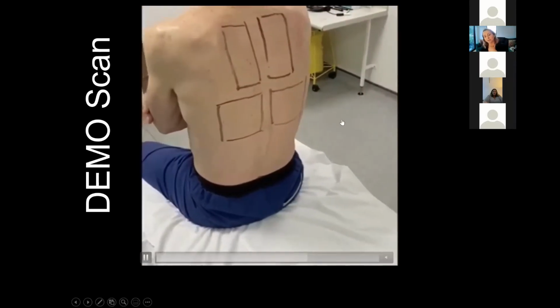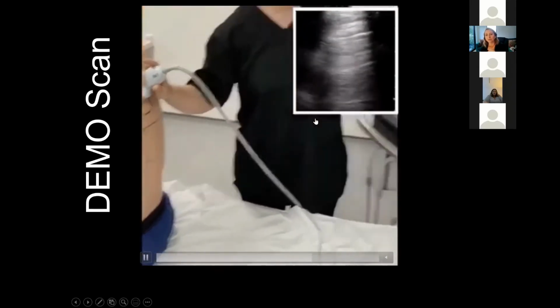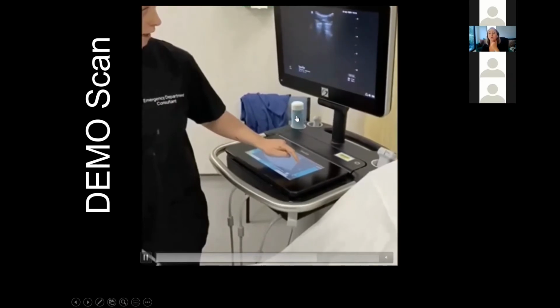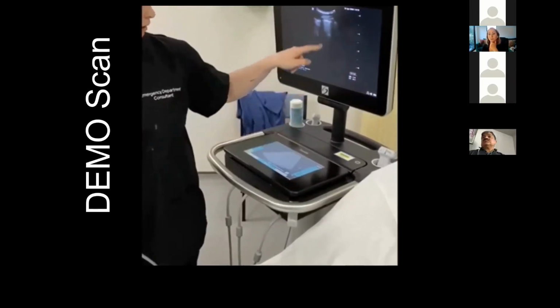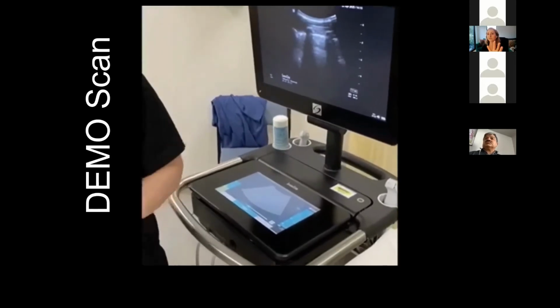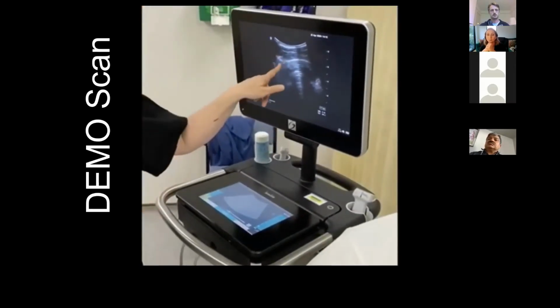And we've got 2 zones here on the back, but you can see they're quite big, so they could easily be split into 3. Pick a zone, do a little slide. Closer to the top, you will have just quite a small space to slide between your spine and the scapula. And then as you come further down, you'll have a little bit of a larger zone to slide across. And most of the pathology is found in the posterior lateral zones, particularly in pneumonias and COVID-19.